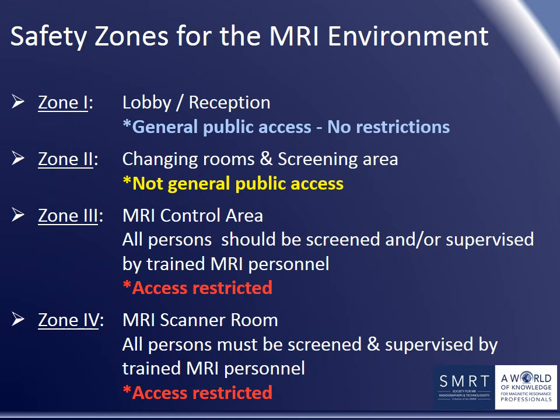Zone 4, the MRI scanner room, contains the MRI system and is also restricted access where persons must be screened and supervised at all times by trained MR personnel.